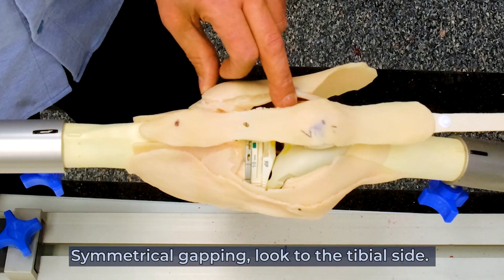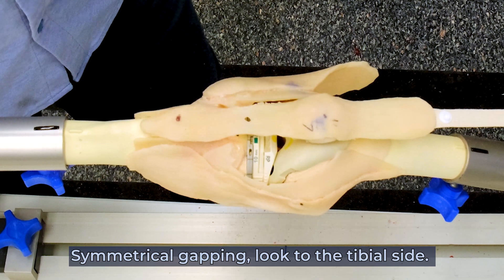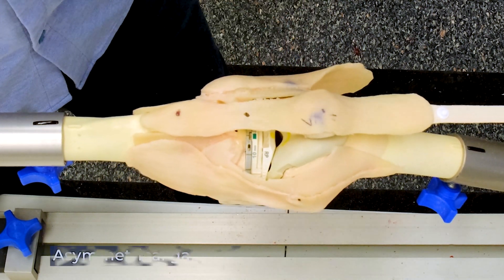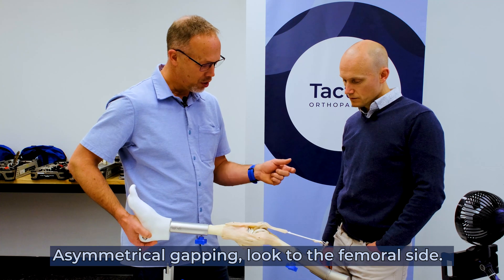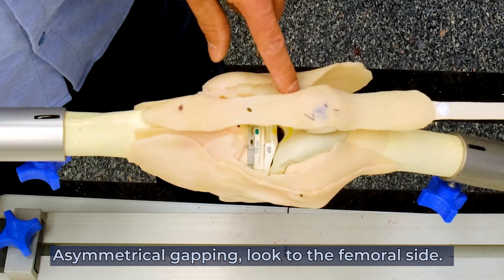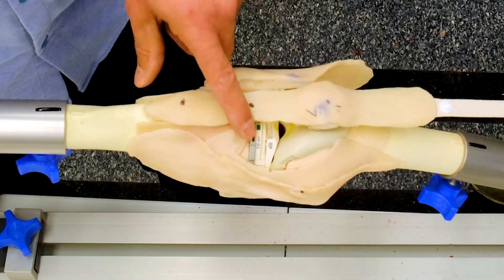If we've got a symmetrical problem in flexion and extension, then we always look to the tibial side. If we have problems which are asymmetric — either in flexion or in extension, not both — then we look to the femoral side. So here we've got a tibial side problem.